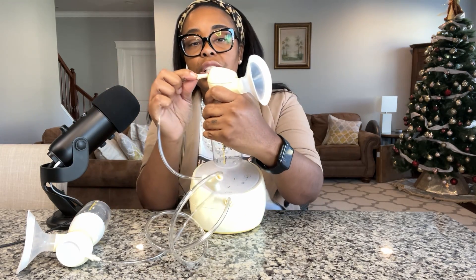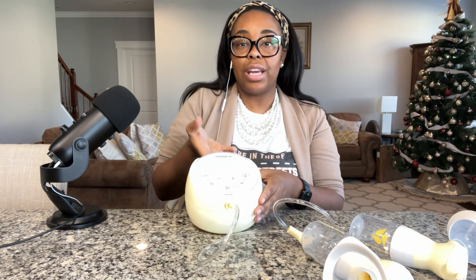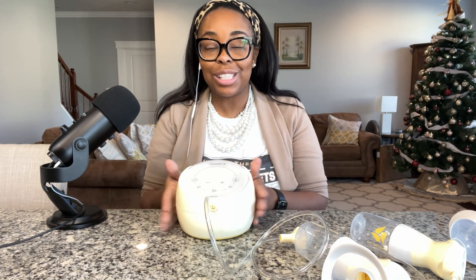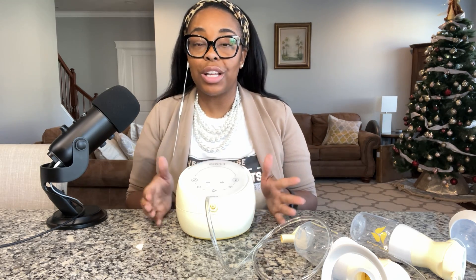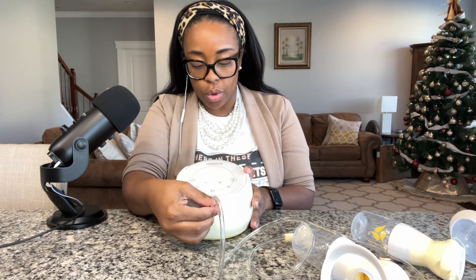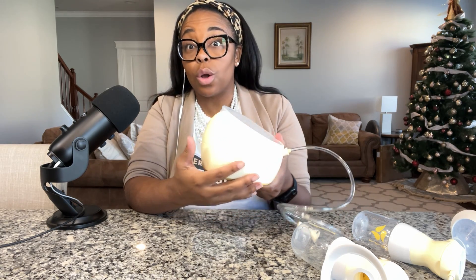The tubing just sticks in the back here — that's how to assemble it. To carry it, there's a little area in the back for your hand. I also want to point out that this is a rechargeable pump — I was pleasantly surprised by that. The charging port is here, and to turn it on the button is here. It's pretty quiet too.